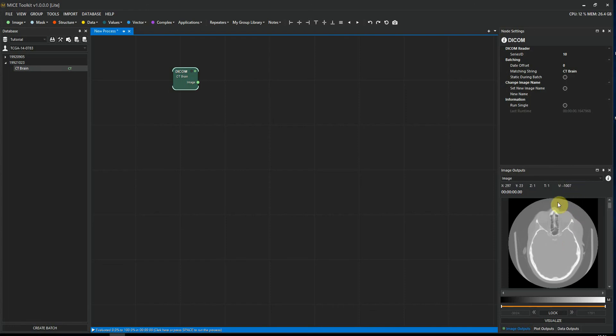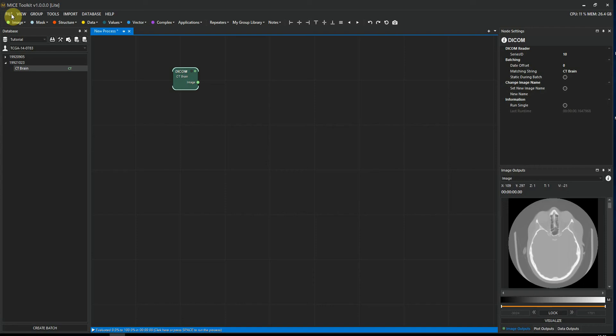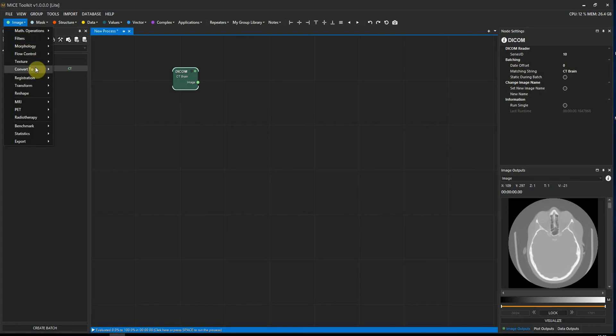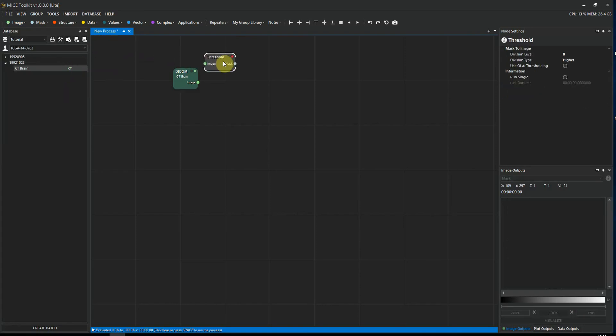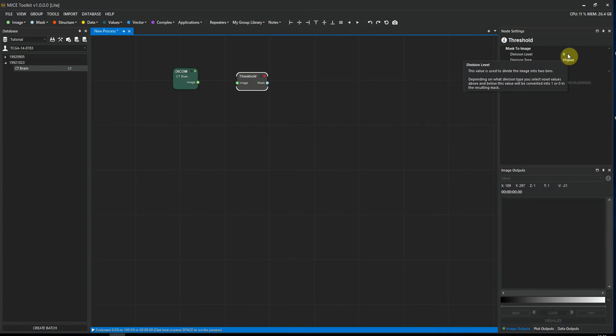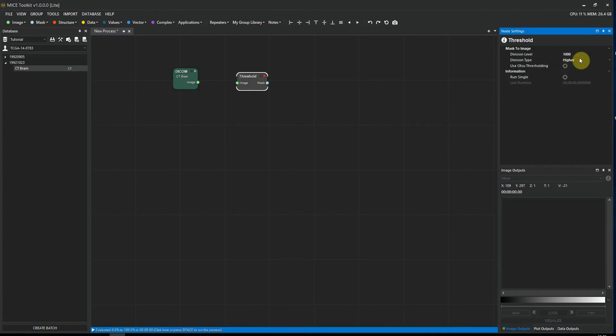Now, let's say I want to segment the bone from this image. And in CT, bone has a Hounsfield unit of about 1000 and above. So in this case, I want to create a mask with voxel values of 1000 and above. And I can do that by going to image convert to mask by threshold. When I select the node, I can see the settings of the node in the node settings panel. In this case, we set the division level to 1000 and we set the division type to higher or equal.